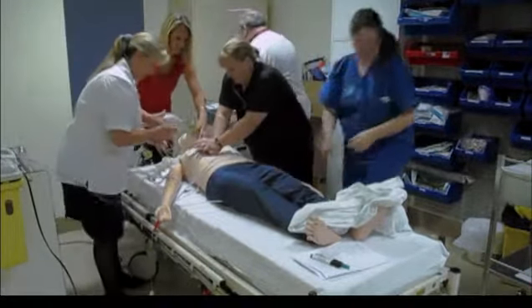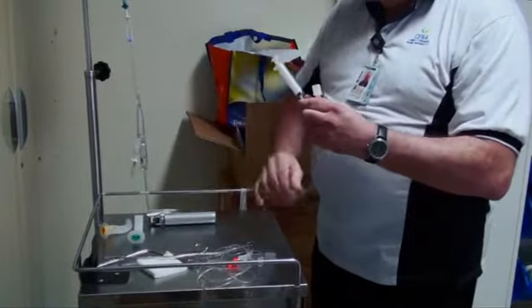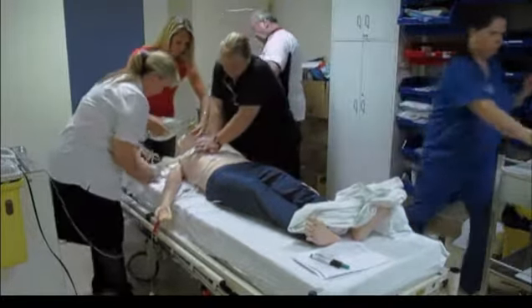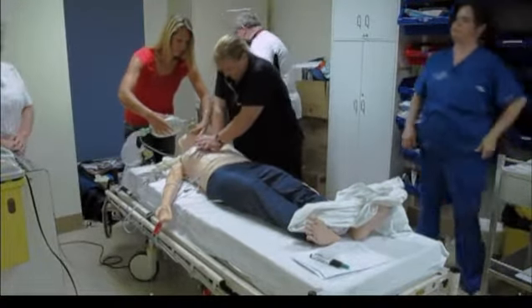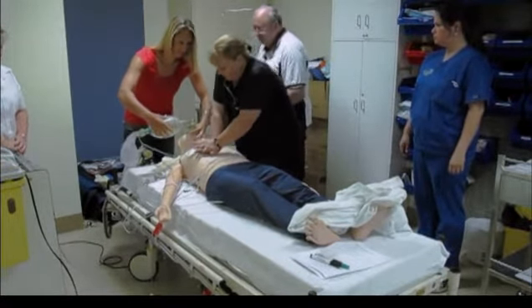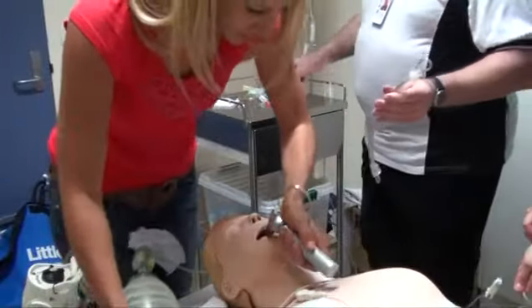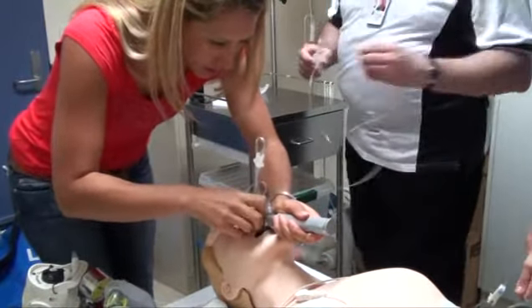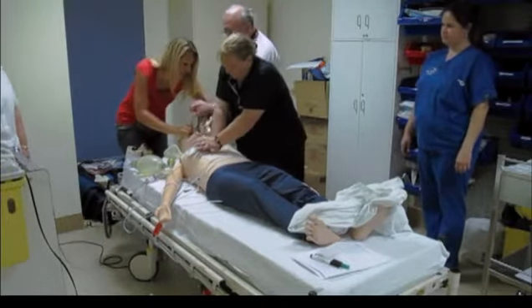So take over the airway. Just send up the blood gas. Okay, thank you. Ready to go? Thank you. Okay, you can emergency introducer.